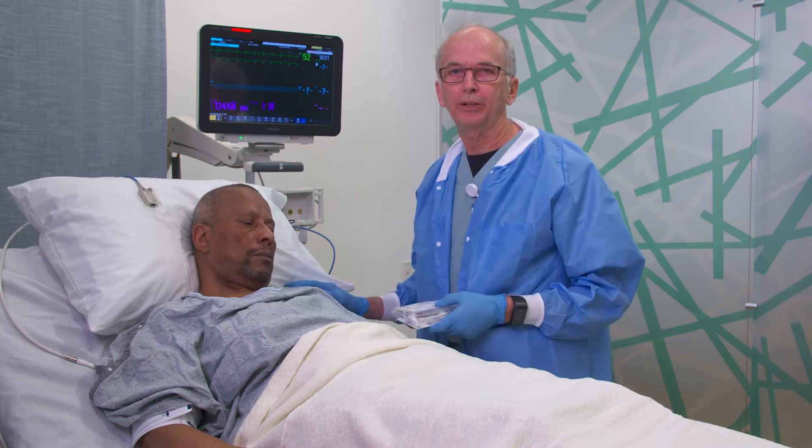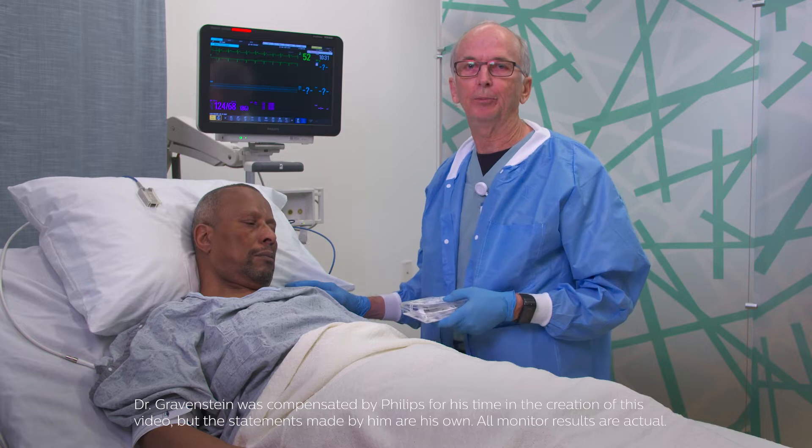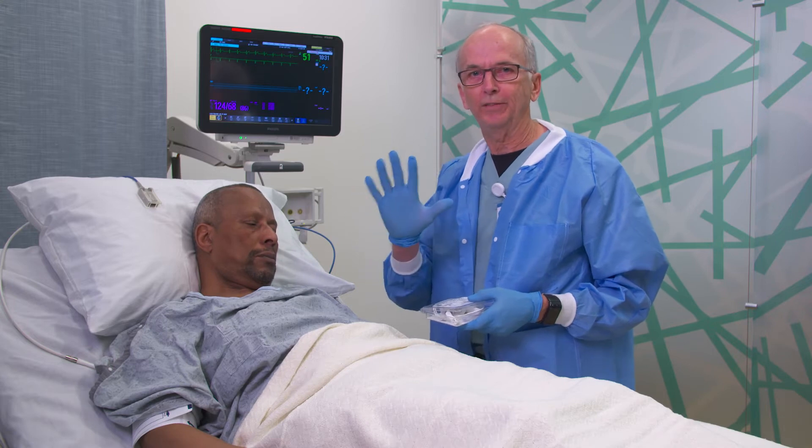Virtually every hospitalized patient has their oxygen saturation monitored via pulse oximeter. These pulse oximeters can be applied in a variety of locations, most commonly on one of the digits.